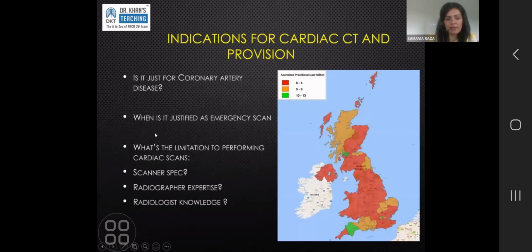While we're talking about cardiac CT, I would like to talk about why we don't do it how we think we should do it, whether that's something for you to think about. We've talked about what the indications for cardiac CT are, what the most common indication is, but given that it's probably the most common cause of death as well, we do need to think why we don't do more cardiac CT.